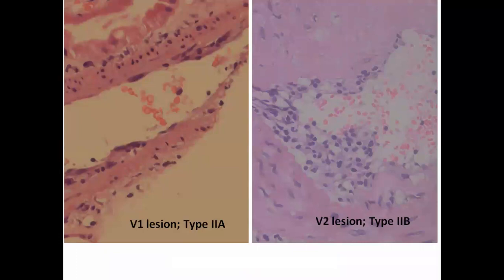So just to highlight in this photomicrograph, you can see that this is a vessel. The spindle, this elongated cell, blue-looking nucleus, is the endothelial cell. What you are seeing here, these are the RBCs. So the endothelium or the spindle-looking cell, endothelial cell, is sitting on the intima. This is the muscle layer, this is media, and outside is adventitia. So there is tunica intima, media, and adventitia. Normally in a non-pathological vessel, you don't see any intima. Intima is seen only as a flat endothelial lining, which you can see here.